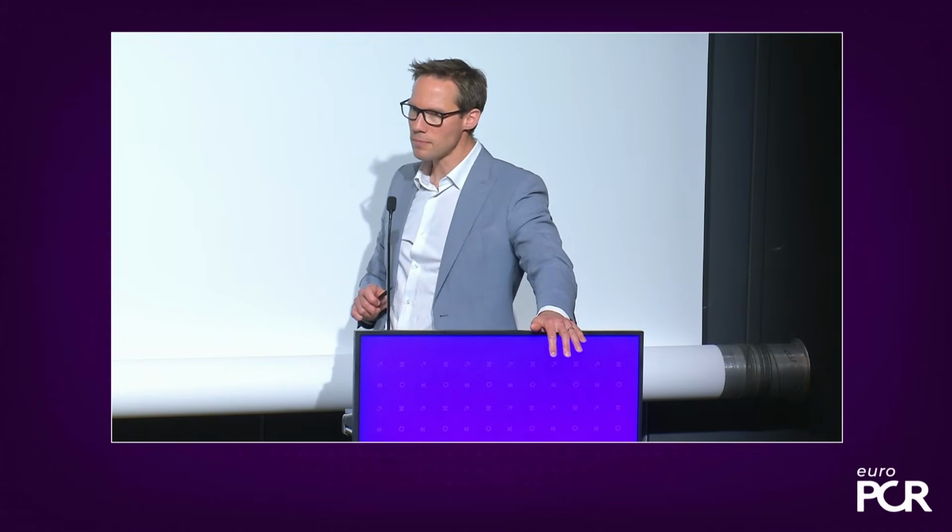Yeah. Thank you so much. I had the chance to have a training with Professor Sondergaard. And there is a pre-shaped formula for getting commissural alignment with Evolut R. It's to keep the flush port at 3. As I noticed in this view, for Accurate Neo it is at 6.